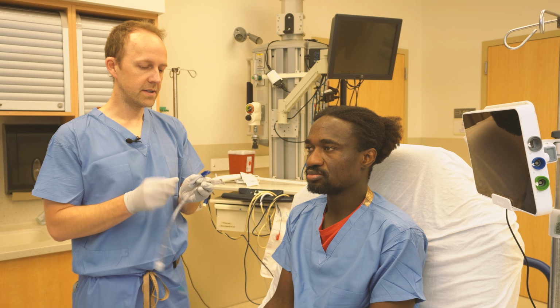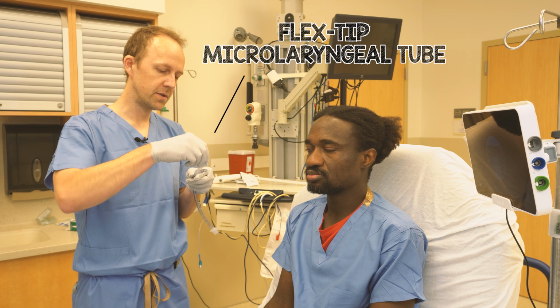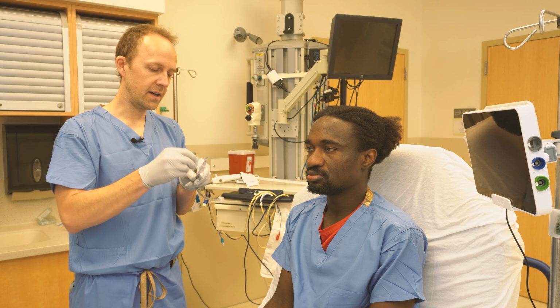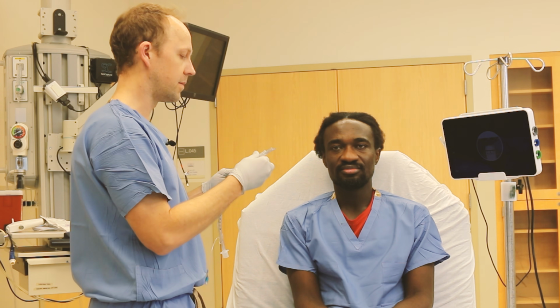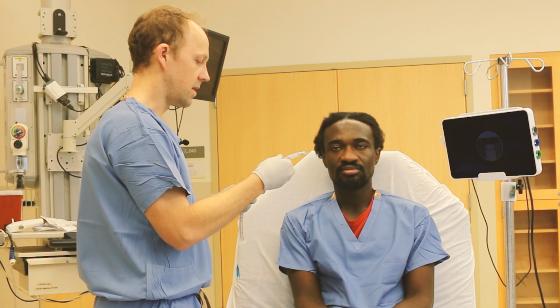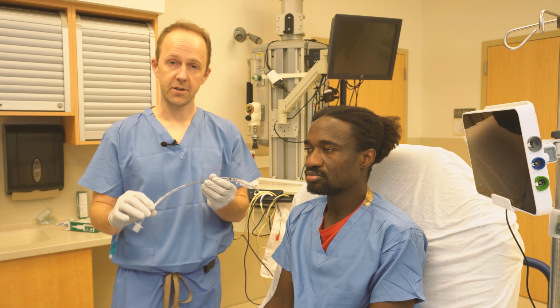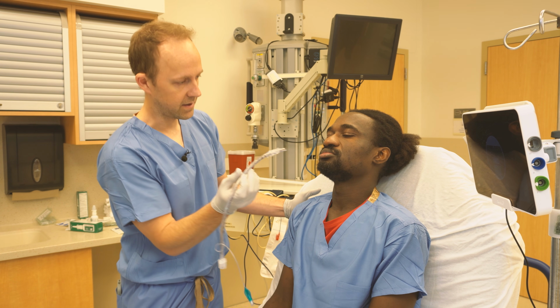Okay, the next step is to insert the tube into the nose. This is a size 6.0 tube, so a little bit smaller because it is much more comfortable for the patient. You want to advance the tube until it's hovering right above the vocal cord, so about 12 centimeters or so as it exits the nose. Again, you can advance this yourself or have the patient. Sometimes patients really prefer to be in control of that.